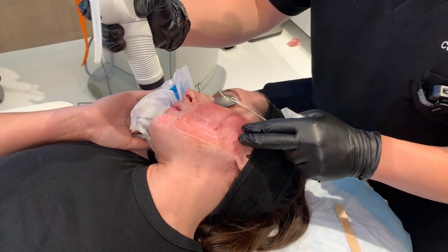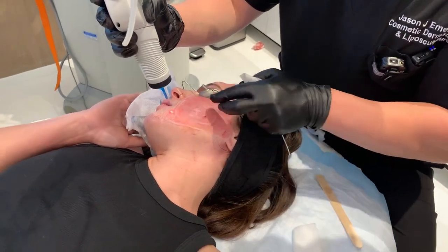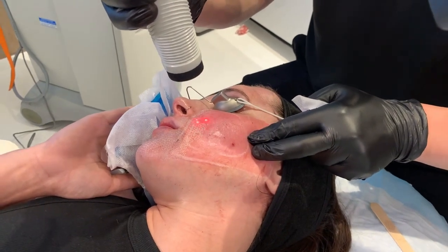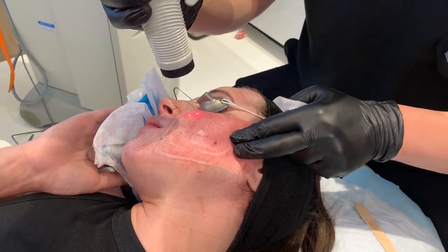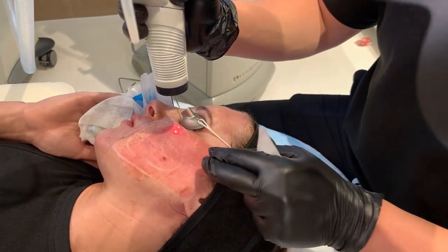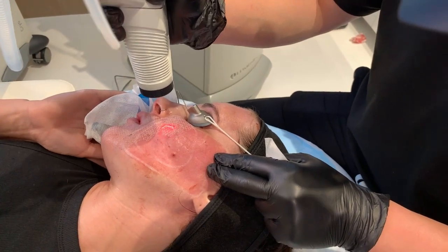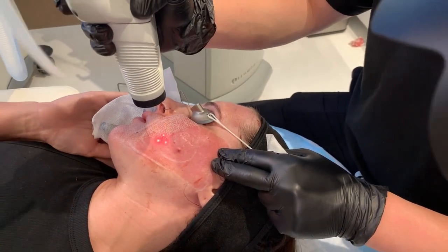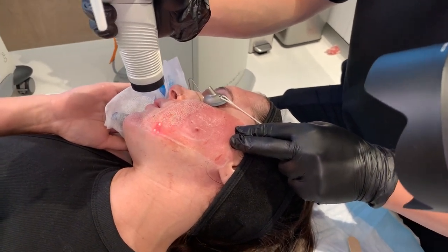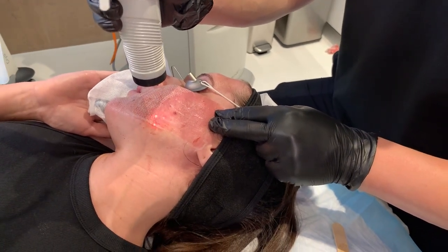shocked. Even though this is a surface laser, you can see the actual burning of the column. This delivers a lot of heat, and that heat goes laterally and deeply. So she's going to still get a lot of collagen production. The difference is, though, we're going to see a lot of peeling. So over the next 5 to 10 days, we're going to see a lot of peeling. She'll probably be a little irritated, a little red. Beyond that, but the last time she did this, it was great.